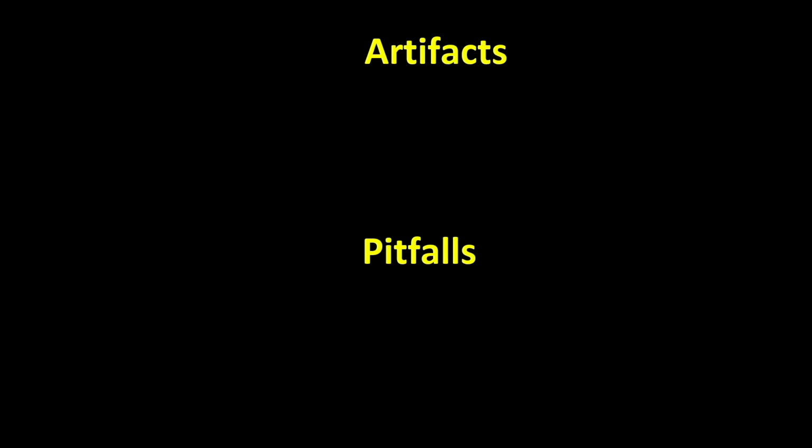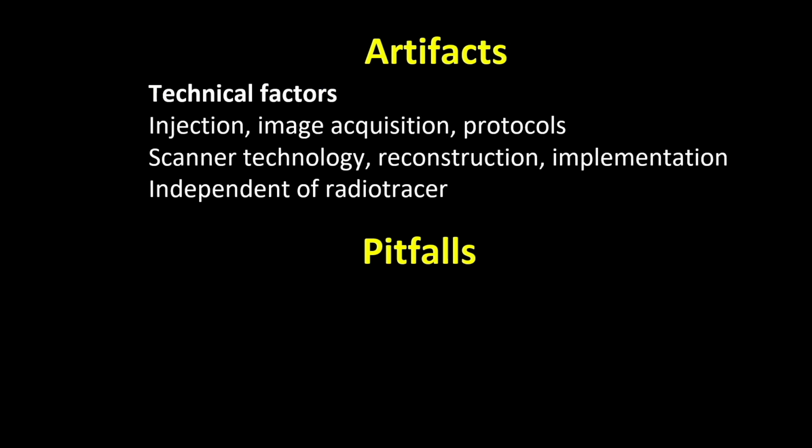different categories. So artifacts are usually related to technical factors. So injection technique, the technology, the image acquisition, the protocols you use, reconstruction, the implementation, and it's independent of whatever tracer you have. So the solutions for solving artifacts is a little bit different.